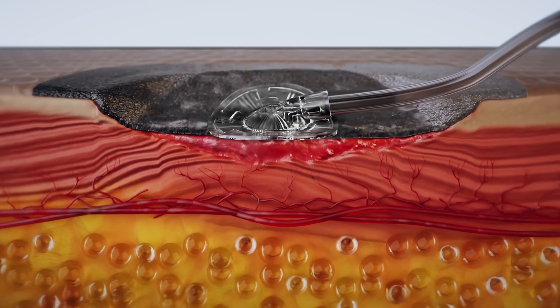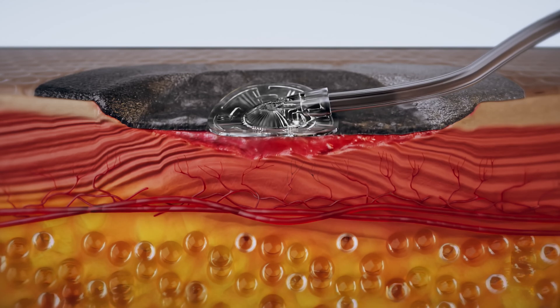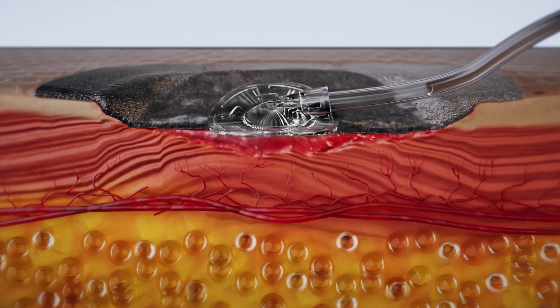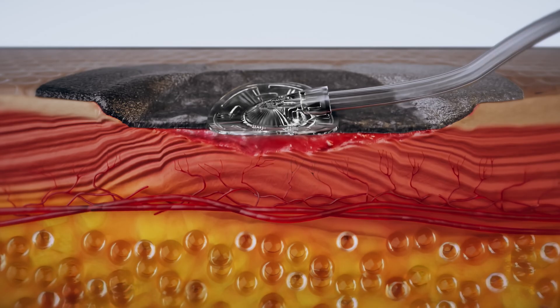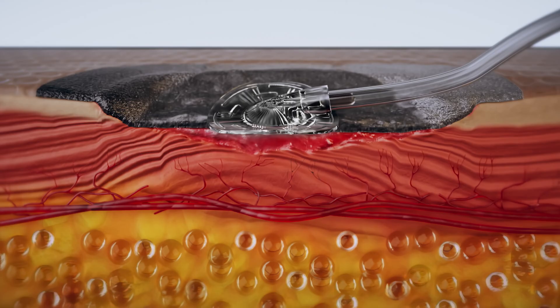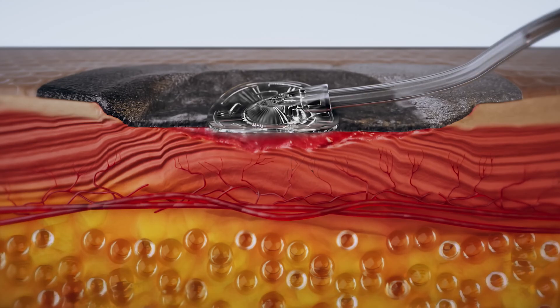The integrated dressing covers and seals the entire wound area, providing a moist wound environment and protecting the wound from external contamination. The application of uniform negative pressure, when delivered by the VAC therapy unit, draws the dressing and wound bed together. In doing so, mechanical forces — macrostrain and microstrain — are applied to the wound bed, underlying tissue, and the surrounding peri-wound skin.